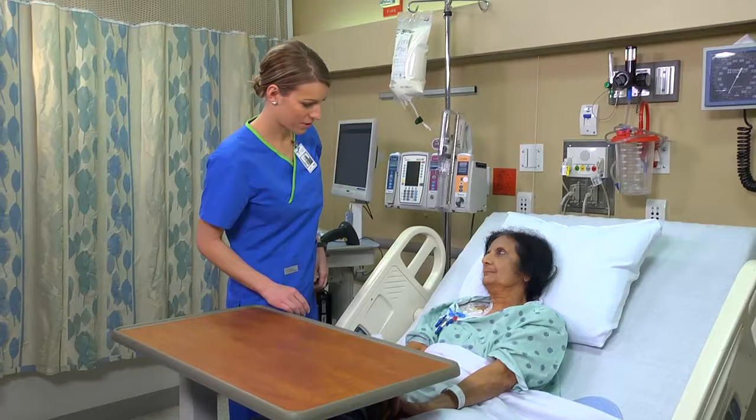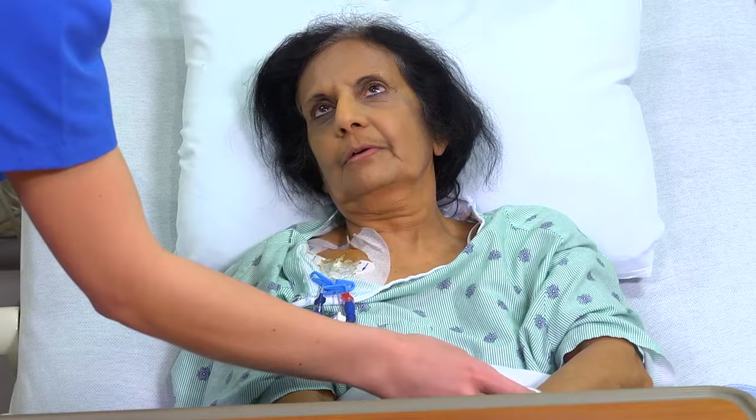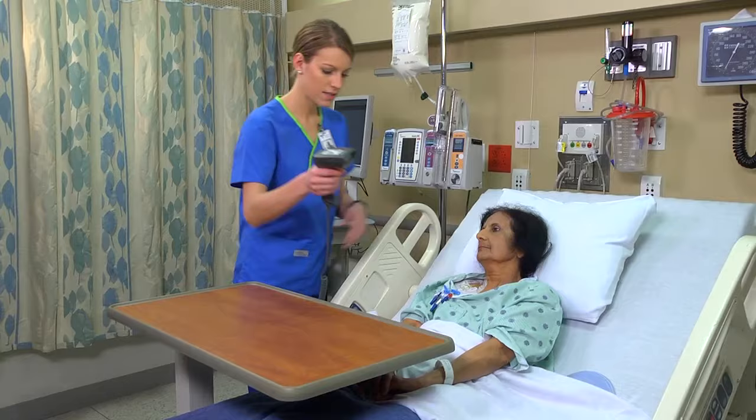Naina Patil. Follow strict aseptic technique during infusion tubing and filter changes. Thank you. These components must be replaced every 24 hours. Change them immediately if you suspect that either has become contaminated.